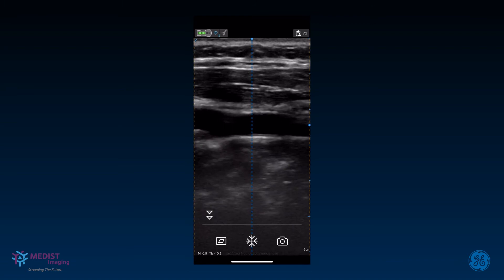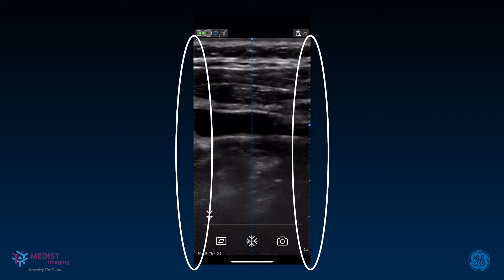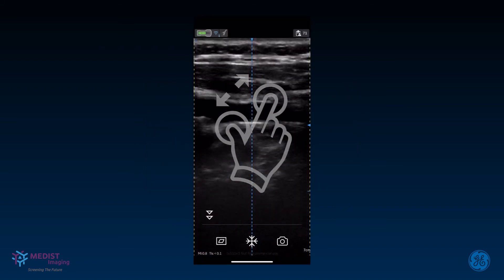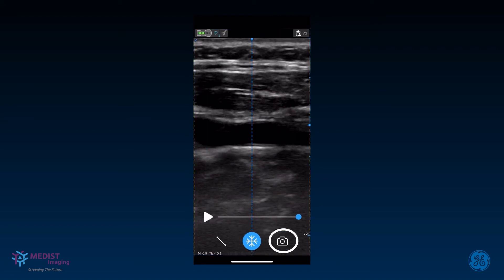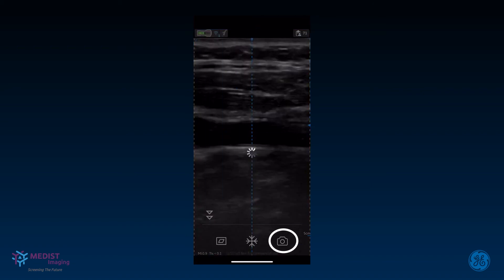Image display is maximized in the portrait orientation for better visualization. At shallow depths on the linear presets, you see two yellow dashed lines on either side of the image, indicating that the entire footprint of the transducer is not being shown to display a large image. To see the entire image, either rotate the device to landscape or zoom and pan. Once a desired view has been obtained, you can save a still image or a video to the gallery. Freeze and press the store button to save a single frame. If you press store during live scanning, a video clip with all the frames in the image buffer is saved.